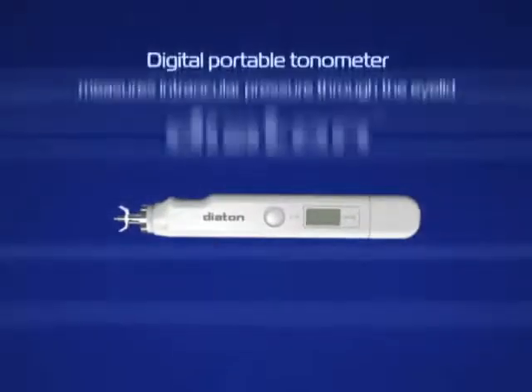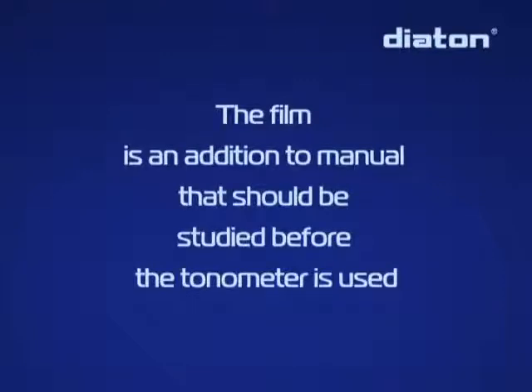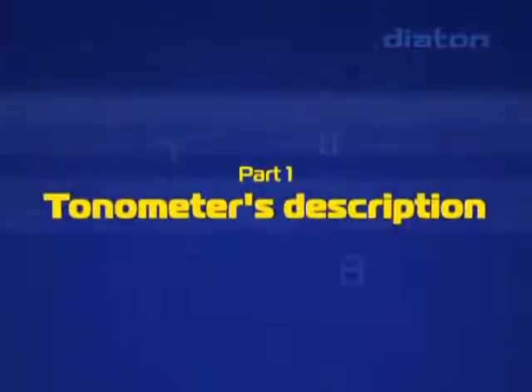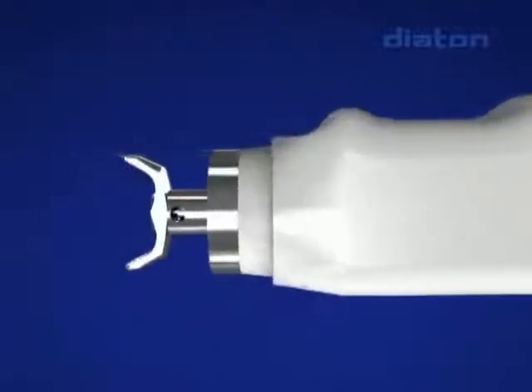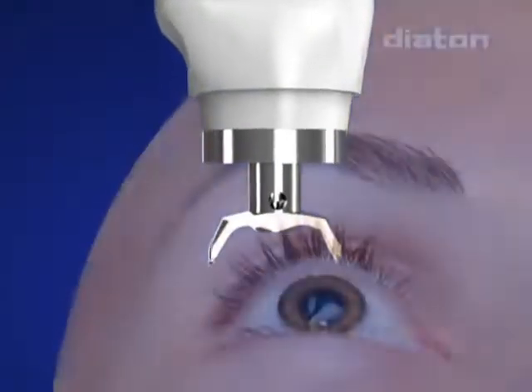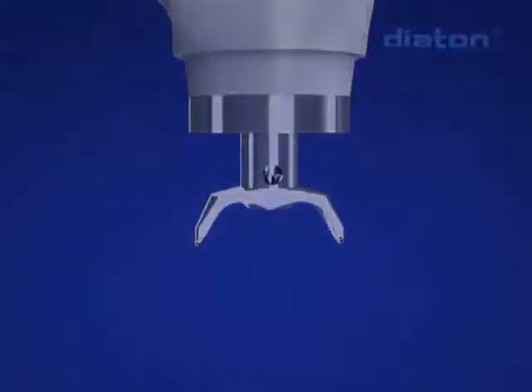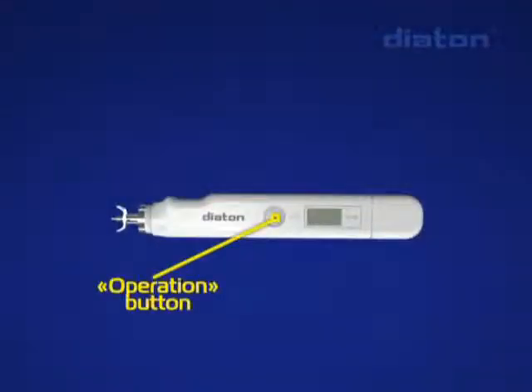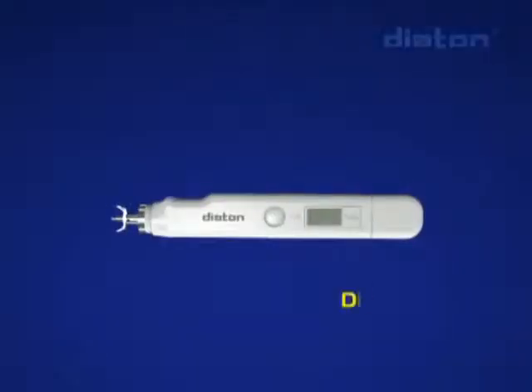The Diatone tonometer measures intraocular pressure through the eyelid. It has an ergonomic plastic body. The tip is intended to fix the tonometer at the eyeball on the upper eyelid during intraocular pressure measurement and to eliminate the damping properties of the eyelid. A free-moving rod inside the tonometer interacts with the elastic surface of the eyeball via the eyelid in the area of the sclera corresponding to the corona ciliaris. The operation button controls the operating modes, turning on and off, automated receiving of IOP results from several measurements, and averaging.